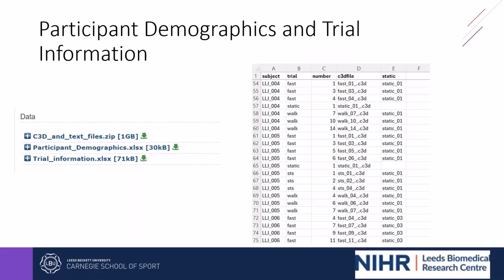So it's important that you recognise that some of the dynamic trials are associated with specific static trials if you're using these in the future. Similarly, if more markers than what we required did actually fall off, then we would have to redo a static trial, and in doing so, we'd reassociate those with the dynamic ones.